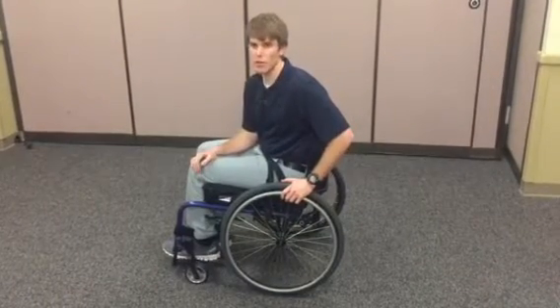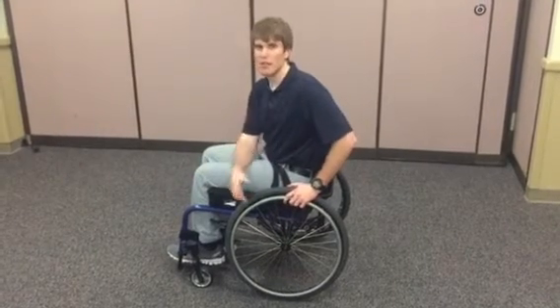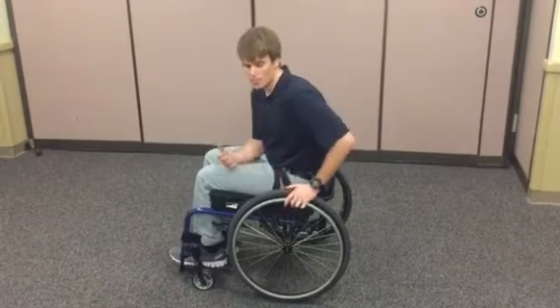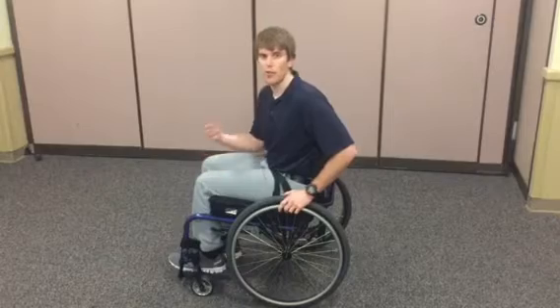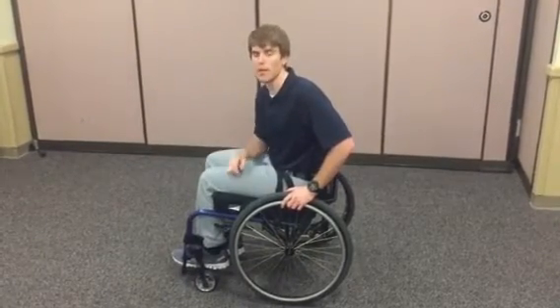Things that might hinder their success with this include decreased hip or trunk range of motion, which doesn't allow them to get into the positions they need, decreased upper extremity strength, as well as the tippiness of the chair. The less tippy the chair is, the more successful they'll be and the easier it is to flip it back up.